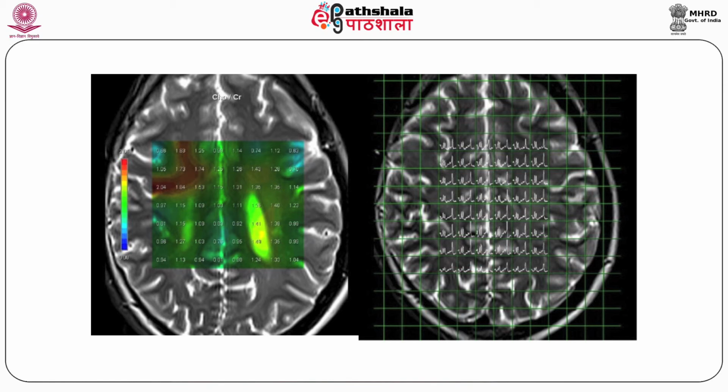Shimming the area of interest. Good shimming is required to correct the magnetic field inhomogeneities prior to obtaining a spectrum. A field homogeneity to the order of 1 ppm over a volume of several liters is needed in an MRI scanner. Water suppression levels checked.